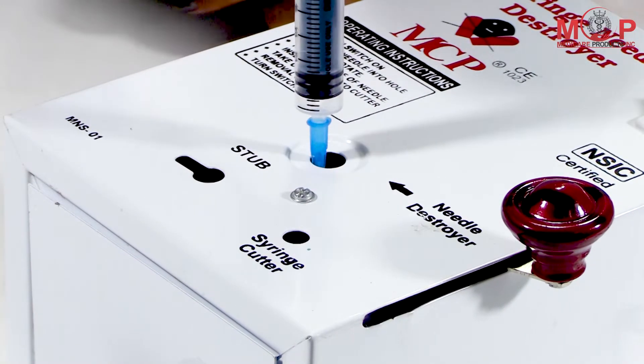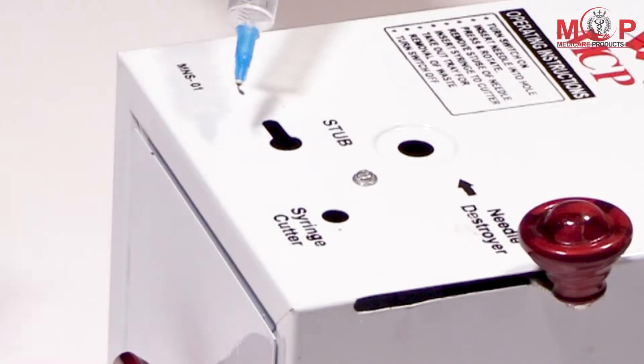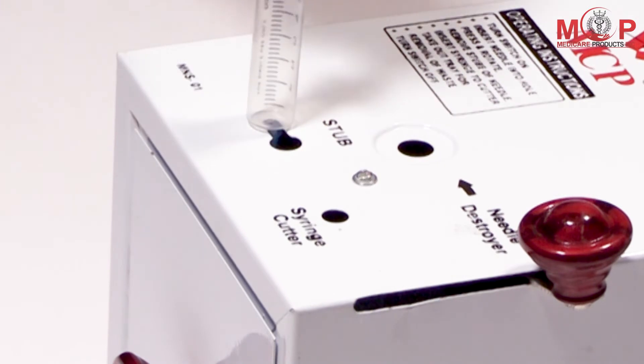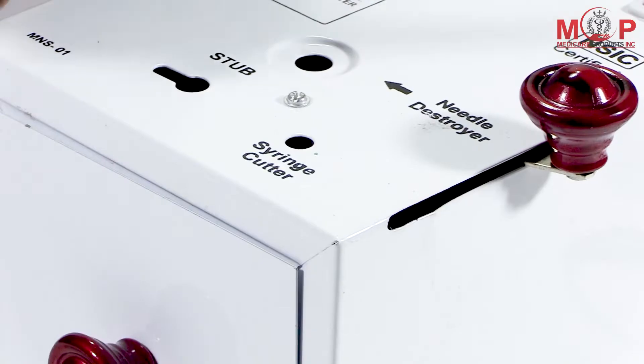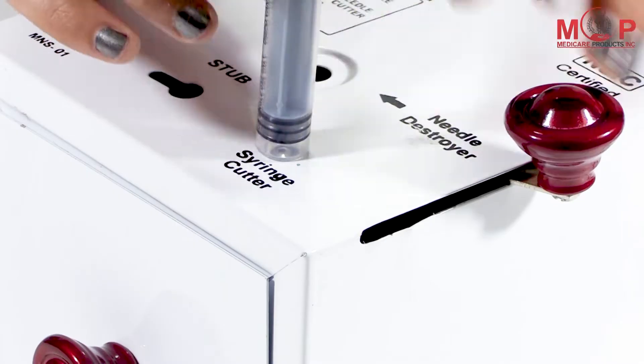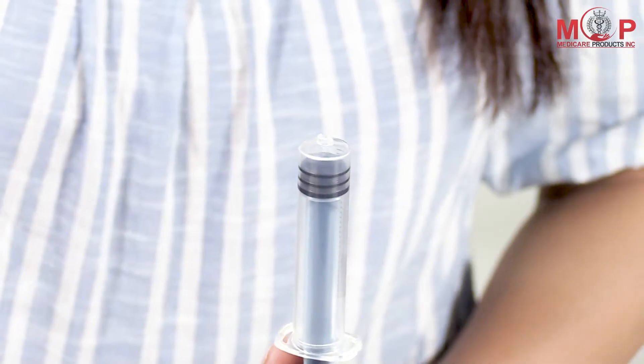Then, to destroy the stub, place it in the stub slot and slide it to the left with a little force. Then finally, insert the syringe in the syringe cutter slot and pull the handle blade downward.